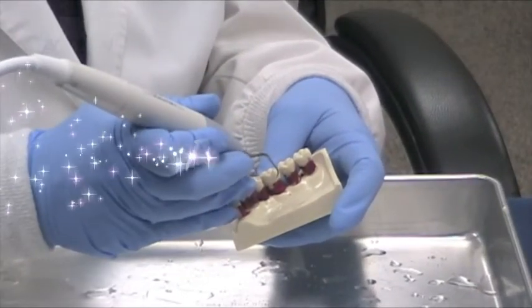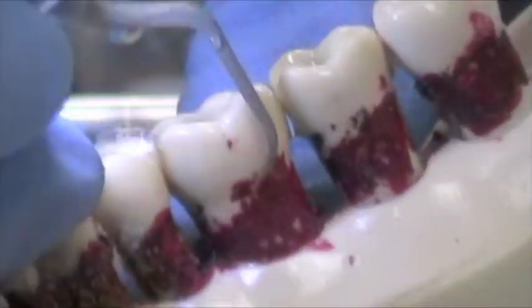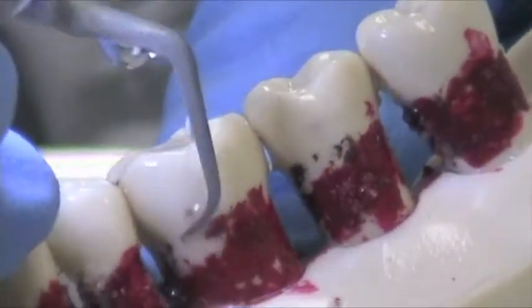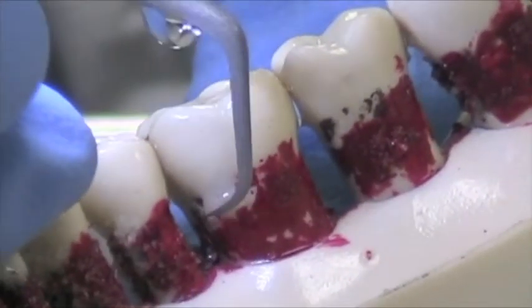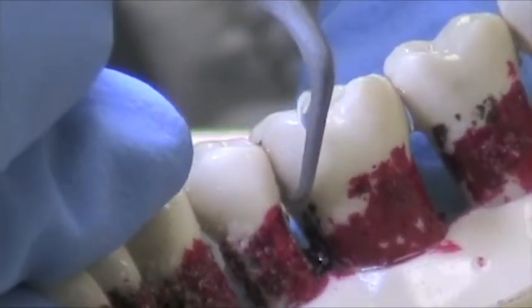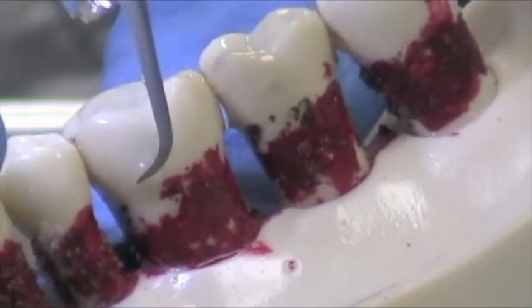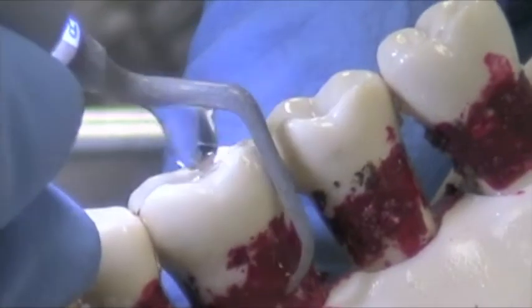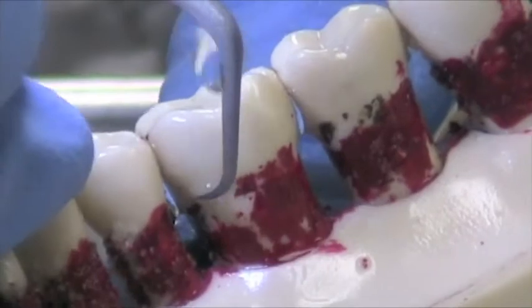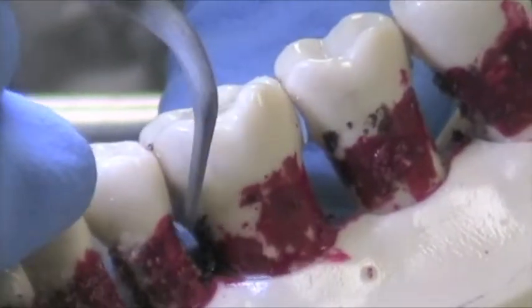Now I'm going to demonstrate the PH2R tip. This is your posterior implant tip. The working edge is right down by the implant, by the cervical portion where the crown meets the implant. You can roll your tip right into the mesial. You can see the drop-by-drop irrigation, which is great when you're working with a patient who has implantitis — the inflammation around there — and it really helps to clear it up when you've got a great tip like this. Slow, methodical movement; very thorough around posterior implants.